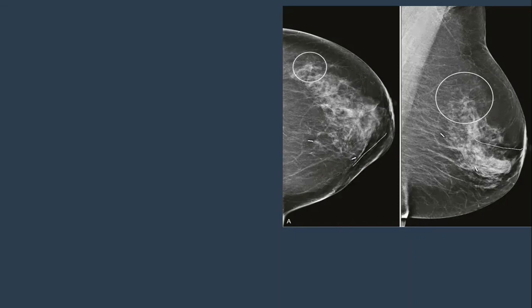To see if there is a suspicious area, such as a residual mass, or after taking the history. I told you she has a previous intervention, like surgery for a previous mass. If she had surgery, then you do ultrasound to see if there is any recurrence, or MRI to see if there is recurrence or residual.